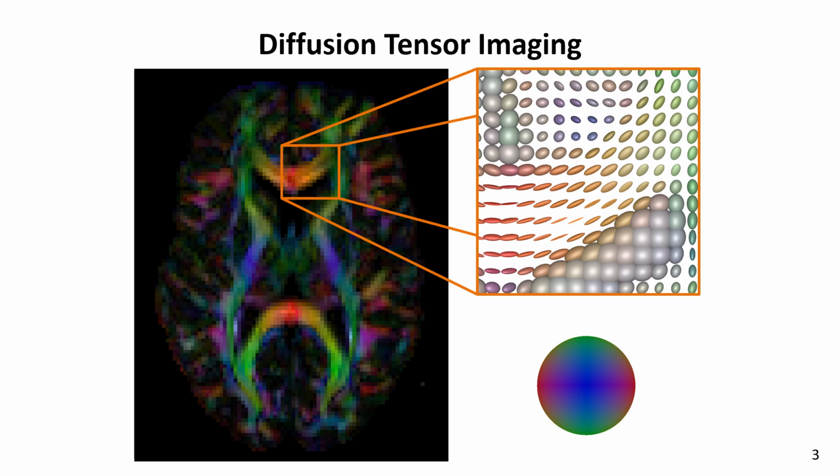This quantifies the directionally dependent diffusivity, and it is sensitive to pathological changes that affect tissue microstructure, such as damage to the fiber tracts that connect different brain regions, or the brain and the rest of the body. A comprehensive visual analysis of this rich information is our challenge.